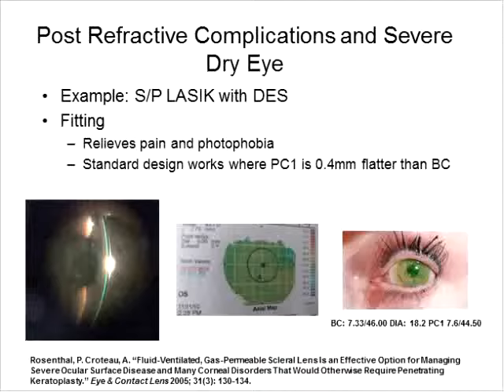When fitting a patient with severe dry eyes, decrease the tear reservoir as much as possible. In this case, the tear reservoir was about 150 microns. Tear debris can form in the post-lens fluid reservoir or on the front surface of the lens, causing decreased vision. Educate the patient with severe dry eyes about periodic lens removal.